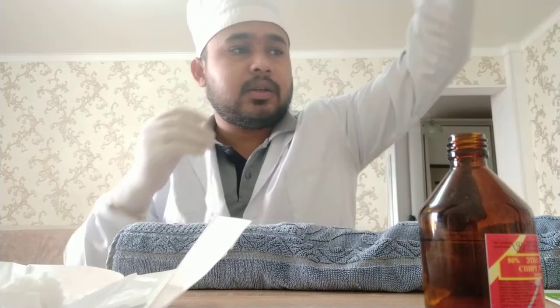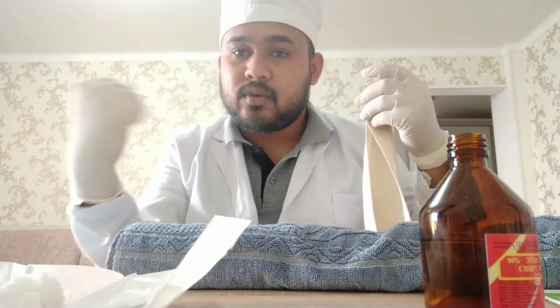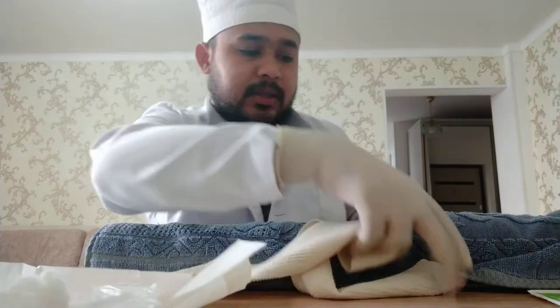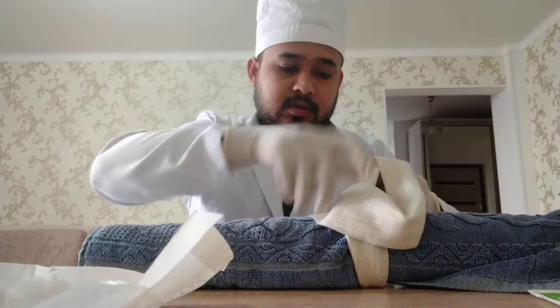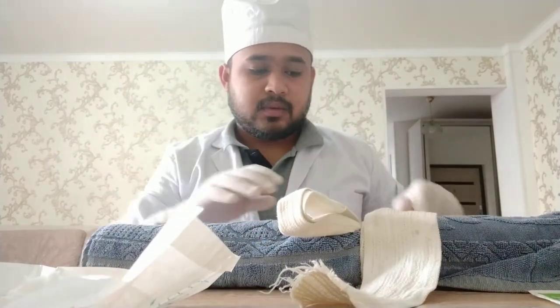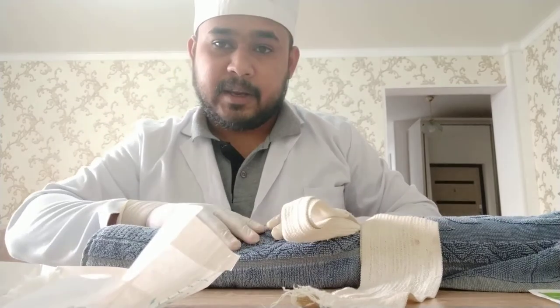Now I will apply the tourniquet to find out the vein and ask the patient to repeatedly compress his hand to and fro. The best easy method of applying the tourniquet is to just tie the hand like this so that untying will be very easy. I tied the hand like this and I will ask the patient to compress and I will find the vein easily.